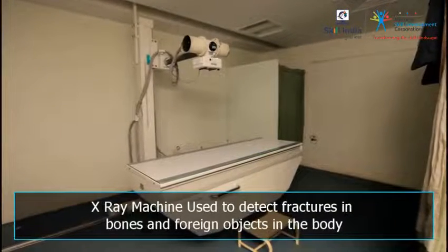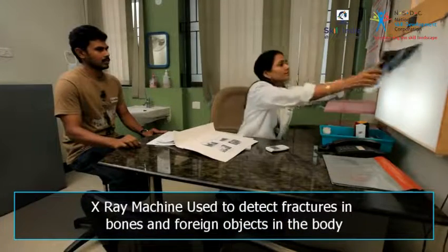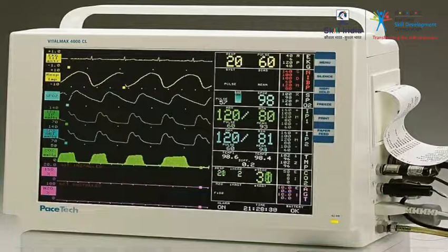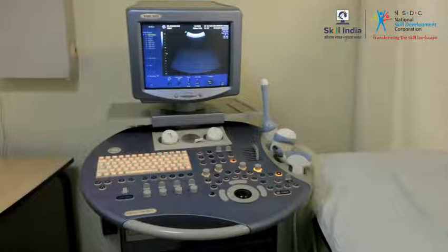X-ray machines help doctors diagnose illnesses, detect fractured bones, cavities, and foreign objects inside the body. An ECG machine detects any abnormalities in heart functions. It is found in the heart disease section in the hospital. Ultrasound machines map the body's interior and produce a visual image of them. One of the uses of the ultrasound is to check pregnant mothers and report the development of the baby.